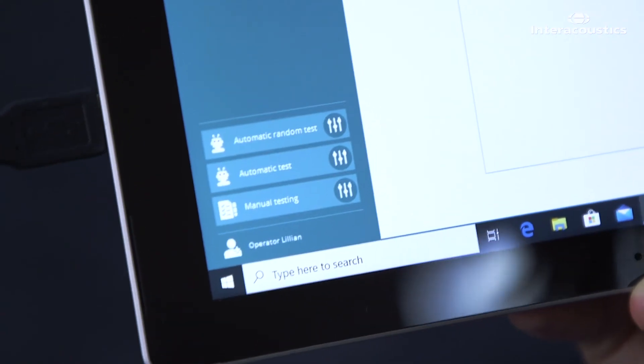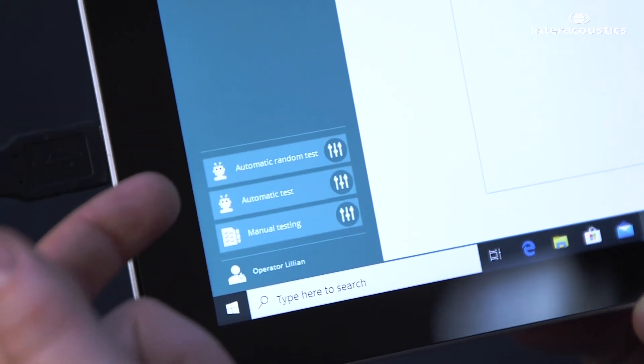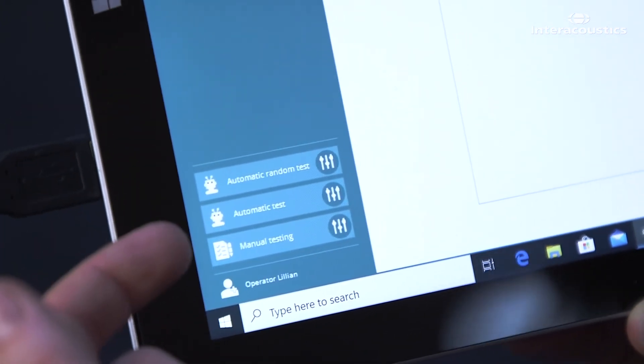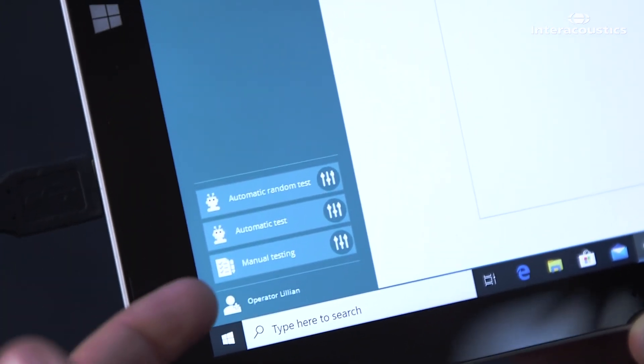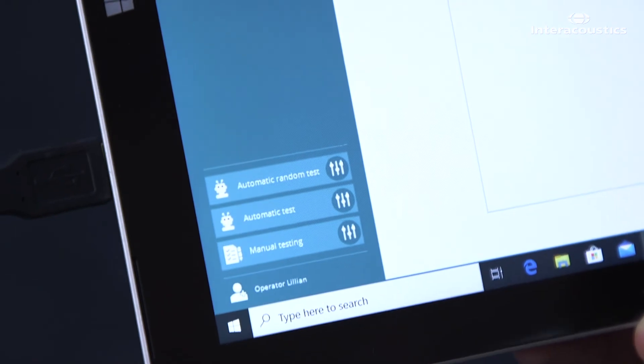In the example here that can be automatic random, automatic or manual. Once selected you are in the running window and you are ready to take in the patient or instruct them in what to do.